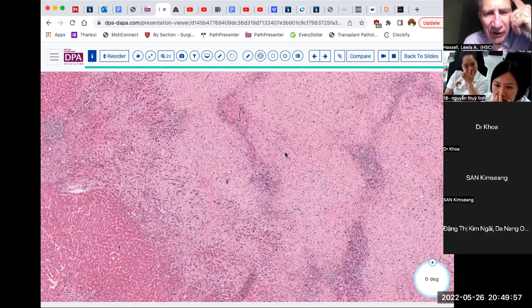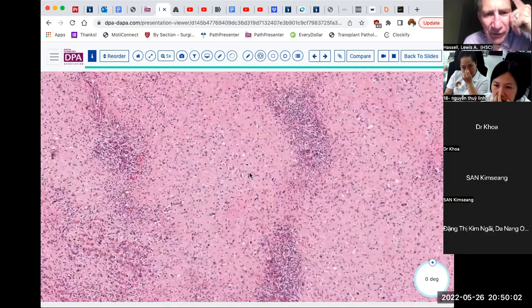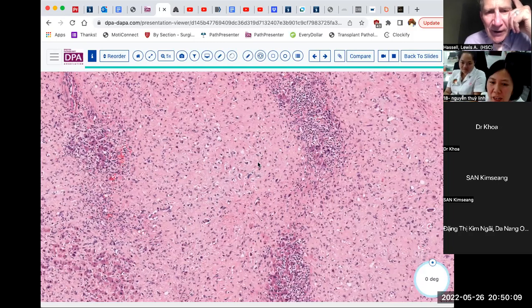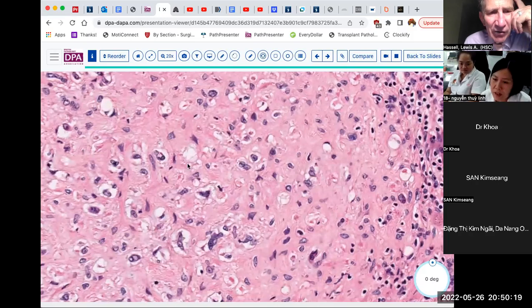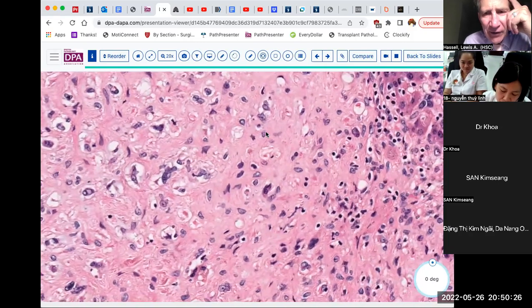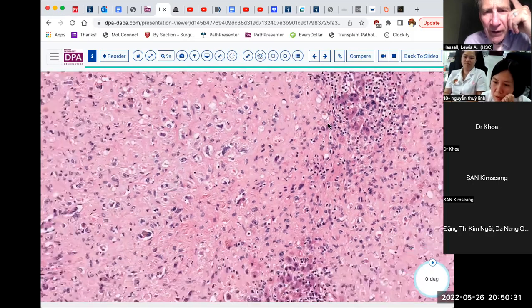And that's why you have this lobular pattern, because that's the way that the growth occurs. So it's quite a distinctive pattern in the liver. This is a helpful feature to recognize as you evaluate these things. Now you might think about amyloid. Amyloid might have a sort of hyalinized matrix, but it would not have the atypical cells, the blister pattern, and lobular pattern of growth that we're seeing here, as well as the luminal features.